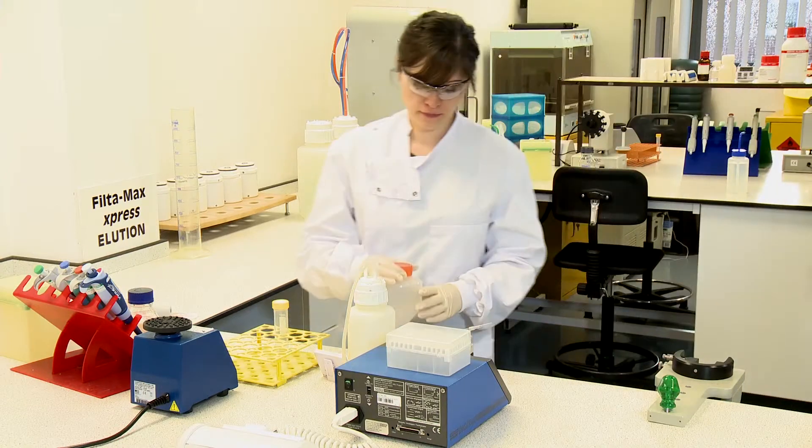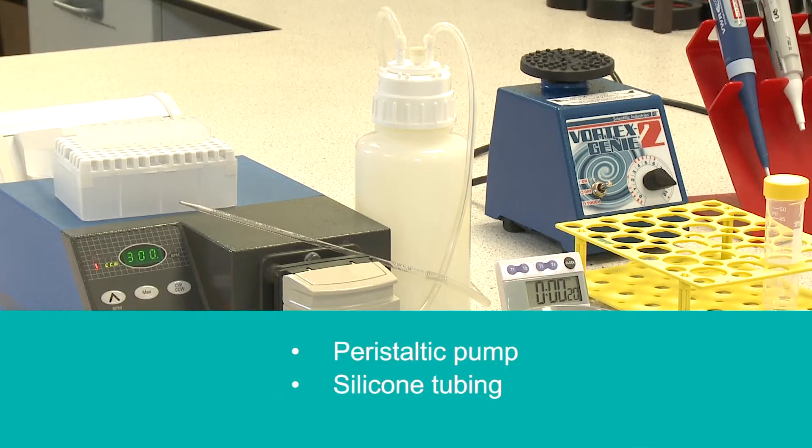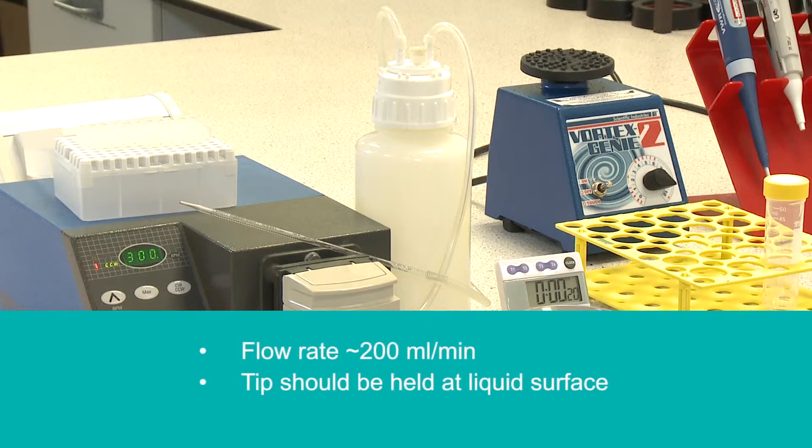Aspiration of the supernatant should be performed immediately following centrifugation using the following recommended setup: peristaltic pump, silicon tubing, 1 milliliter serological pipette, wide bore disposable tips, flow rate about 200 millilitres per minute.